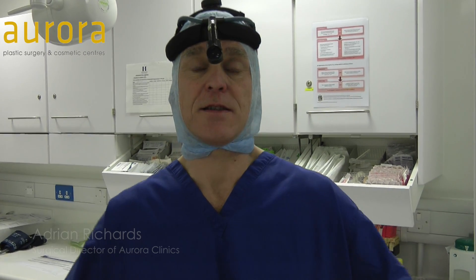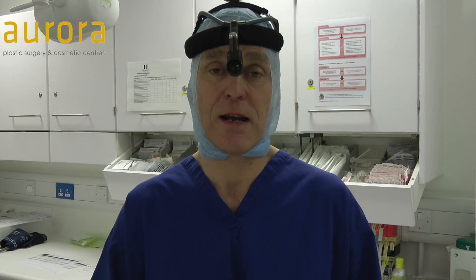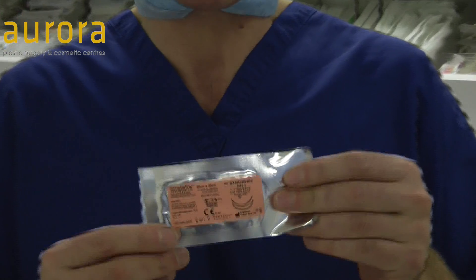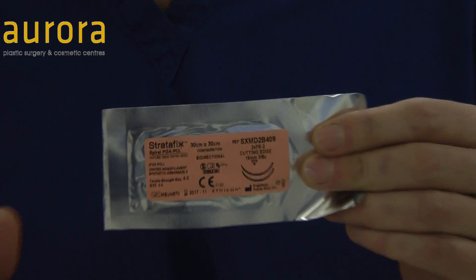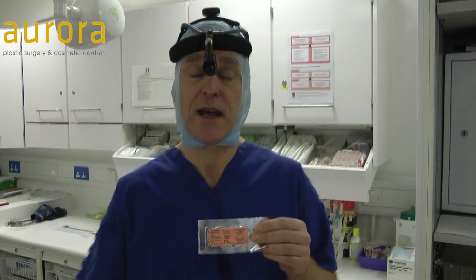I just thought I'd show you something very interesting. It's a sort of new stitch we're using. It's a very simple idea, but we really like it. It's basically a stitch made by Ethicon, which is one of the main stitch manufacturers. What's interesting about this stitch is, I'll show you using it in a second.